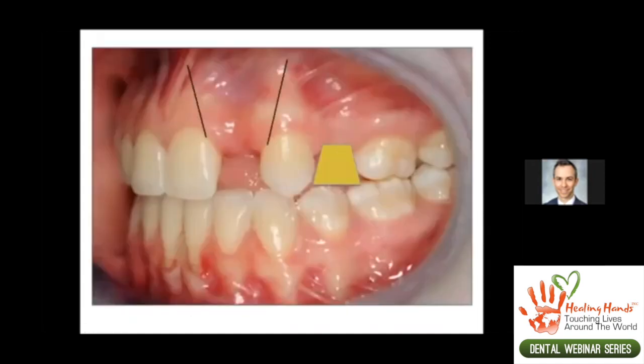So another incision design, if we want to build bone a little bit beyond this area of the papilla, we can make a vertical release that includes the papilla. But again, we may be concerned about loss of papilla tissue. So suturing that back with vertical mattress sutures, and very precisely, is important.